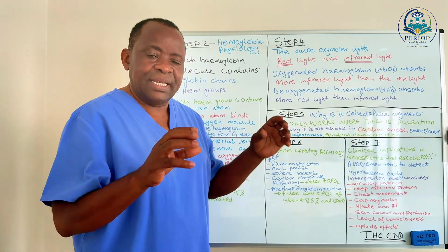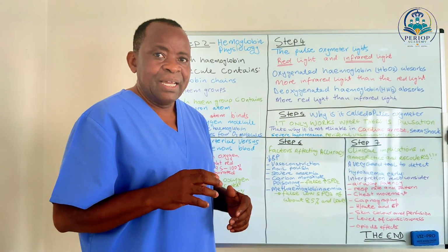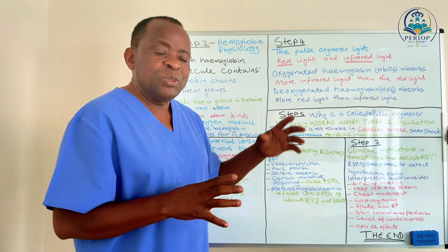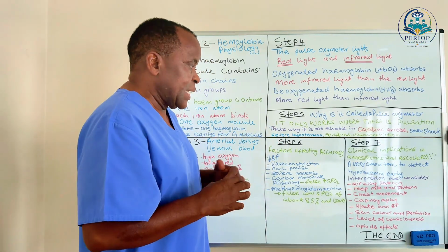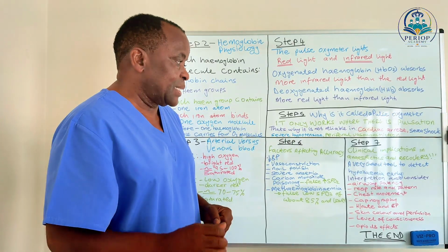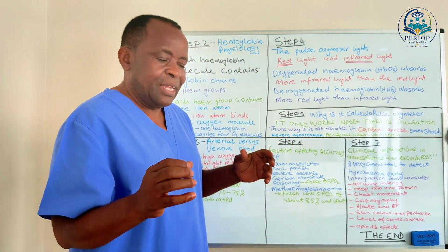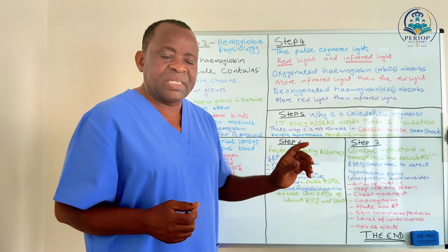Any specialist, any clinician who works in this environment, in theatre, in anesthetics and recovery, has to have knowledge or try to understand better how this gadget works, because understanding this pulse oximeter and how it works helps us to take action in order to minimize the issue of hypoxemia early.